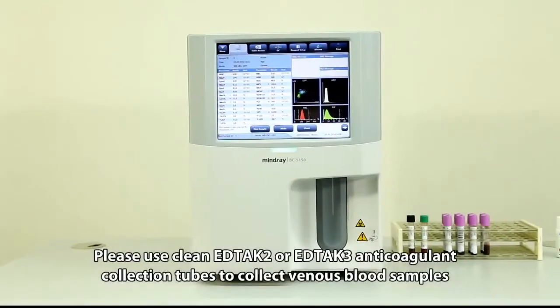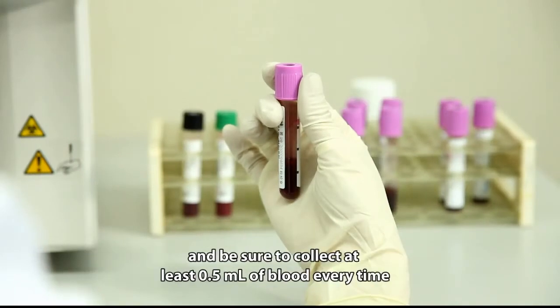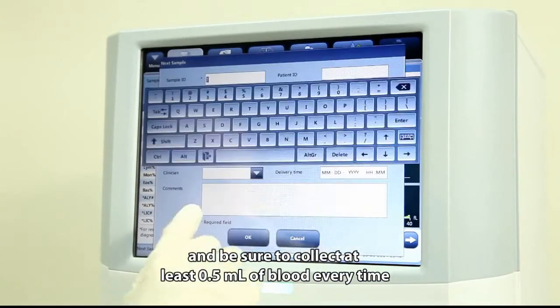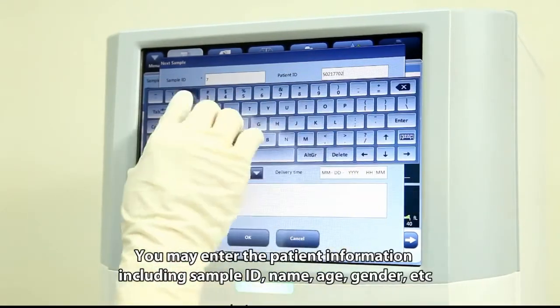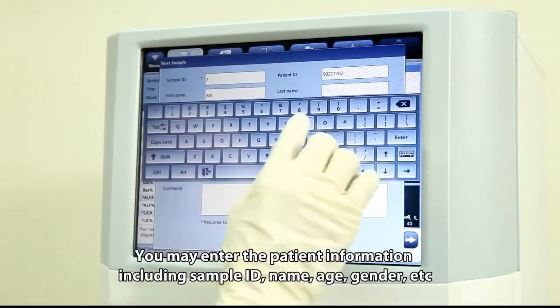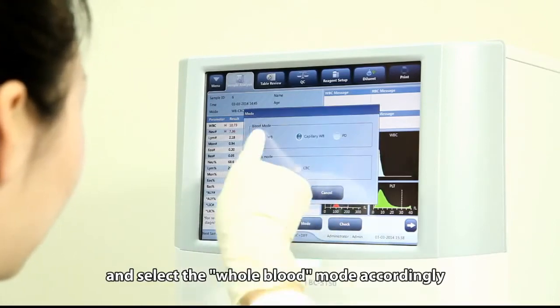Please use clean EDTA K2 or EDTA K3 anticoagulant collection tubes to collect venous blood samples, and be sure to collect at least 0.5 milliliters of blood each time. You may enter the patient information including sample ID, name, age, gender, etc., and select the whole blood mode accordingly.